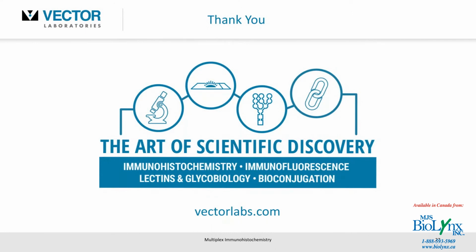I think with more than that, you may start to run into some background problems with cross-reactivity as well. So I'd say certainly 3 or 4 would be a key target that you'd look for for successful multiple antigen labeling using the chromogens. Okay, great.